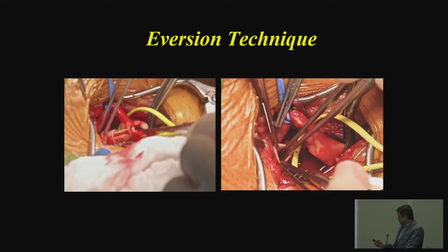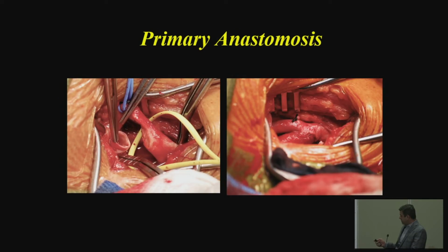And as we start to work, you can see that the plaque is held right here, and the artery is just basically peeled off of that plaque. And so the plaque will come out almost 2-3 inches long as we actually remove it from the body. And then we would repair or clean out any of the common or external, and then actually just sew the two arteries together. So here is the internal, here is the external, the common, the little defect right here where you're sewing it back together, and this is what it looks like afterwards.